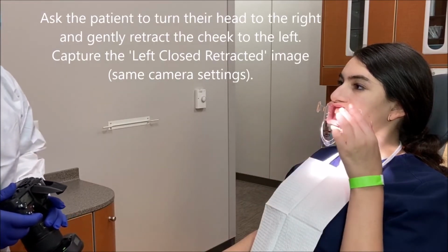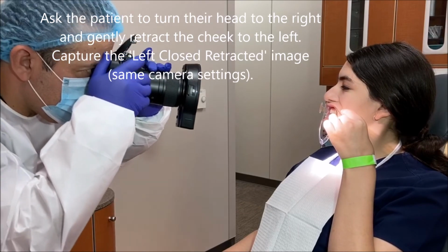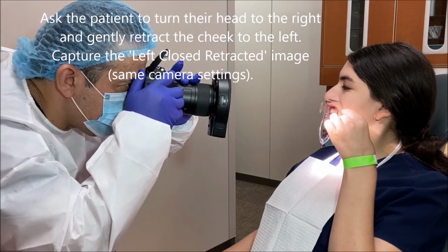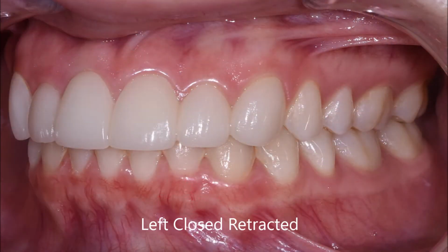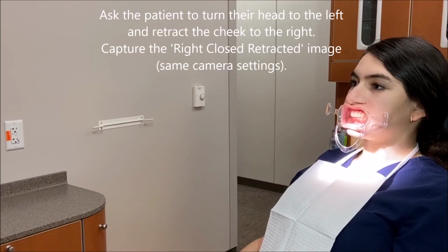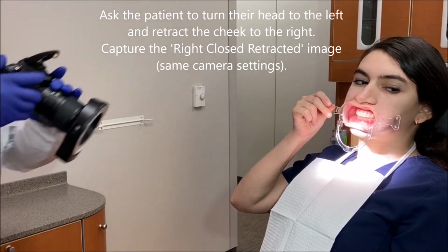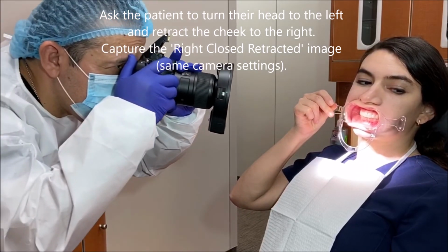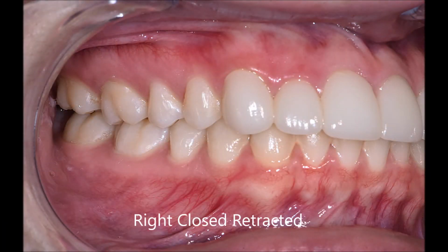Ask the patient to turn their head to the right and gently retract the cheek to the left. Capture the left closed retracted image, same camera settings. Left closed retracted. Ask the patient to turn their head to the left and retract the cheek to the right. Capture the right closed retracted image, same camera settings. Right closed retracted.